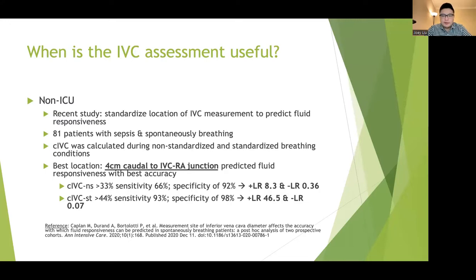Non-standardized breathing patterns would be just the patient's own tidal respirations, whereas the standardized breathing conditions were quite intricate, with devices that measure how much pressure the patients are exerting when they're inspiring and expiring, so that they can standardize the measurements. A little bit complicated, but the outcome that applies more to real world scenarios would be patients triggering their own breaths.